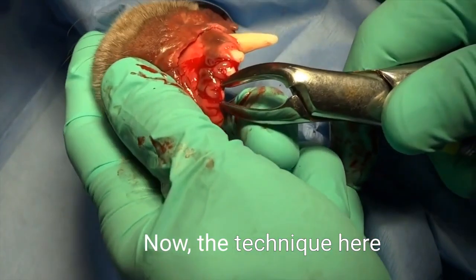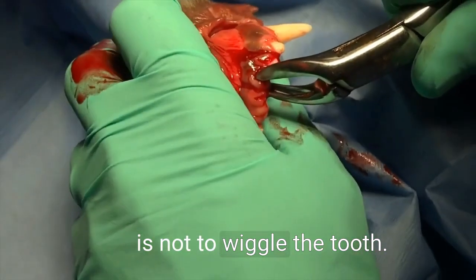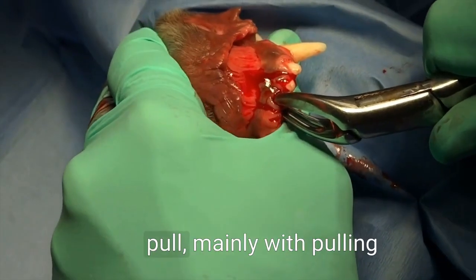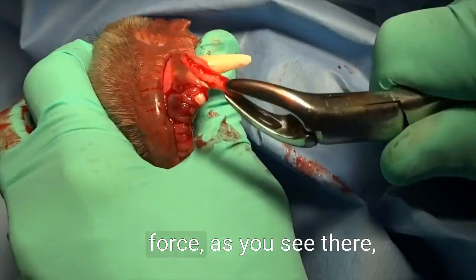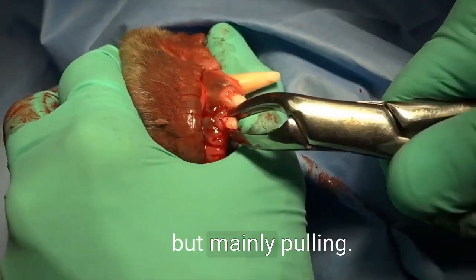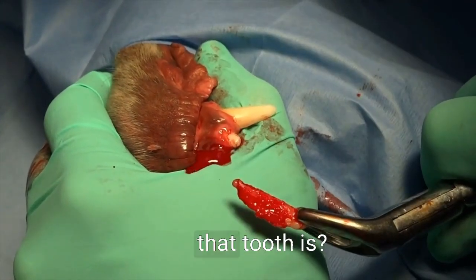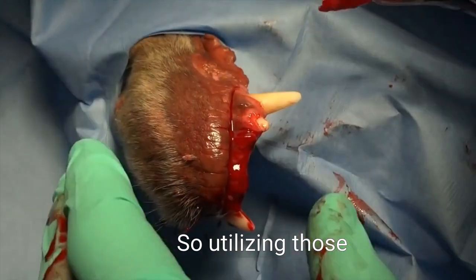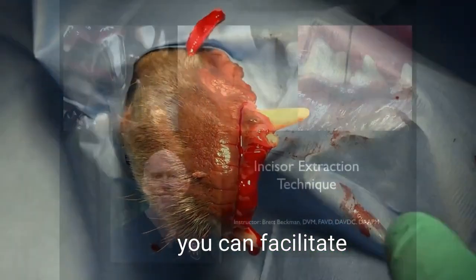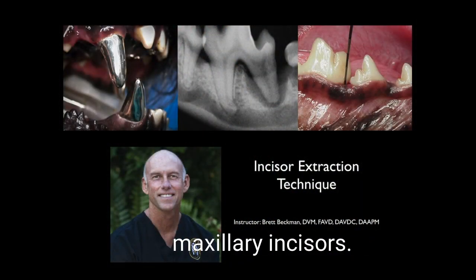The technique here is not to wiggle the tooth. The technique is to pull mainly with pulling force, as you see there, and a little bit of torque, but mainly pulling. You can see how I'm pulling straight out. You see how flat that tooth is? Utilizing those simple techniques, you can facilitate efficient extraction of the mandibular and maxillary incisors.